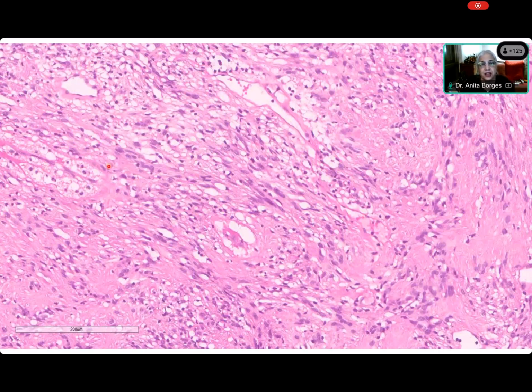You see this? And you know what it reminds you of? We just saw it a little while ago. What does it remind you of? You saw something like this a little while ago. What is it? Saida? You saw it in that gastrointestinal stromal tumor. You saw the vacuolation of the cells, and you saw the coalescence of the vacuoles within the cells, and the cells then die out. And that is why you saw that there were pseudocysts over there.